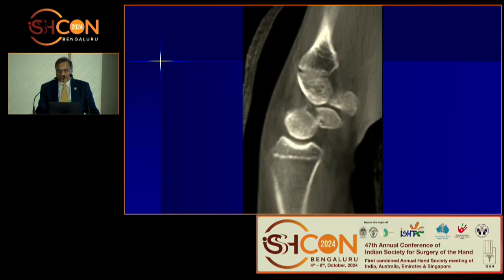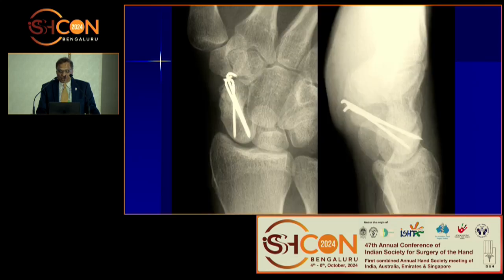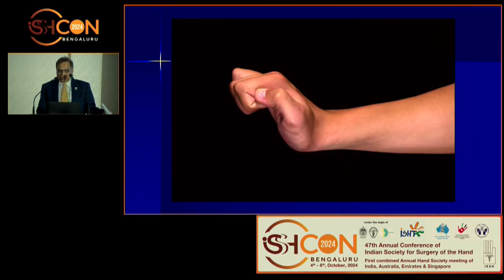We've looked at the CT scans. Now there's a humpback deformity in the acute situation. So we go from the volar side and open it up. For me, I find this much more reliable. I can open up the scaphoid and correct the humpback deformity, and this patient wanted to go into the military, so didn't want any hardware, so we ended up fixing with K-wires, which we took out, and because it was filled with compact cancellous grafting, this healed up very readily. So young patient, humpback deformity, diagnosed with CT scan and fixed, and went on to full union with excellent function.